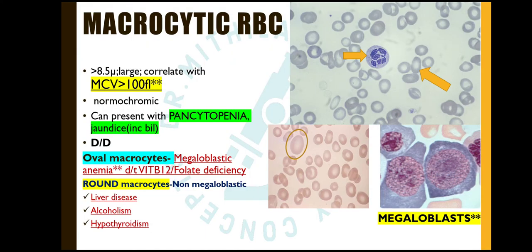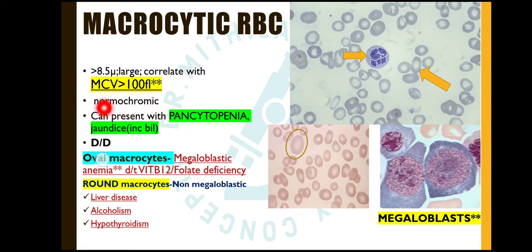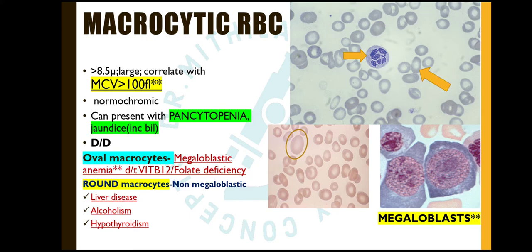Next we come to macrocytic RBCs. Macrocytic RBCs are larger in size — more than 8.5 microns — and correlate with a mean corpuscular volume of more than 100 femtolitres. These cells are normochromic, so MCHC will be normal. Megaloblastic anemia is the most common cause of macrocytic anemia and can present with pancytopenia because there is a defect in nuclear maturation affecting all cell lineages.